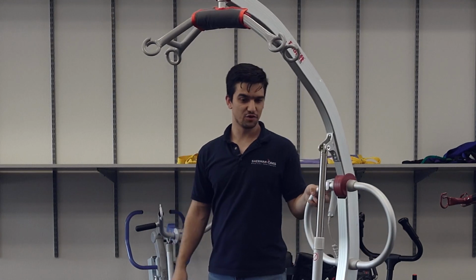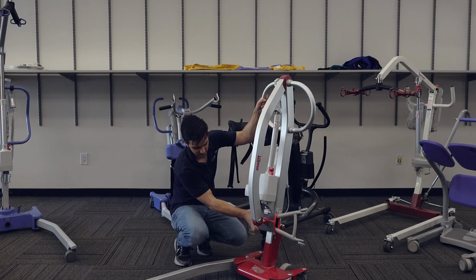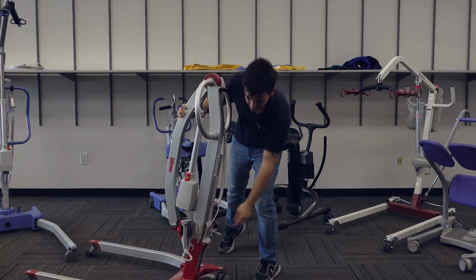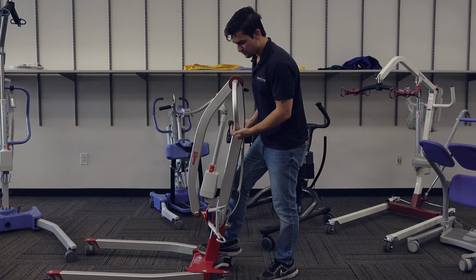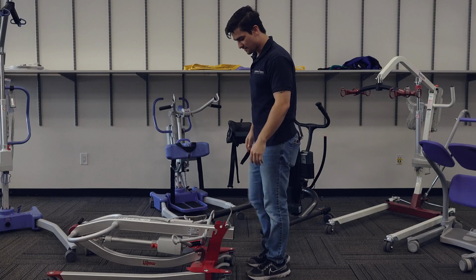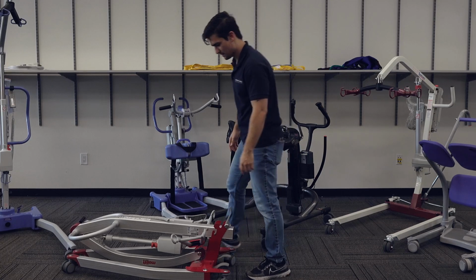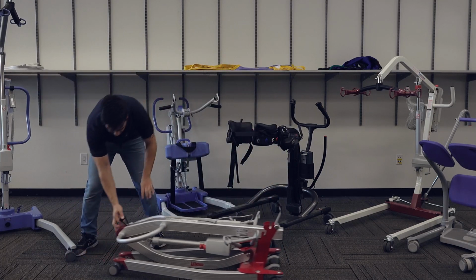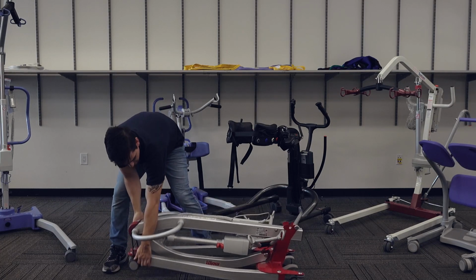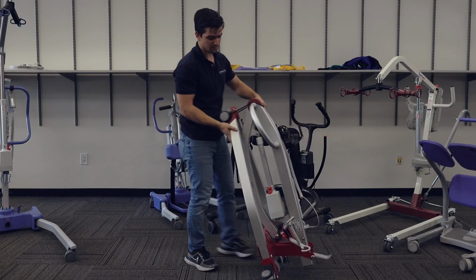So the first thing we're going to do is make sure we lower that boom all the way down. Once we lower this all the way down, we have a plastic piece here where this hooks into. Then in the back of the lift here, there's one lever. We're going to lift it all the way up, put one foot onto it, and pull it up and push forward. It's going to come all the way down. And then there's the hydraulics here, which bring the legs in and out. So we're just going to bring the legs of it all the way in. And then the final step is that there's just a bungee cord here. So we're just going to tie that around the wheels just so it doesn't open up. And now we're able to stand the unit as well. And if we did need to wheel it around like a dolly almost, you can also dolly it around as well.